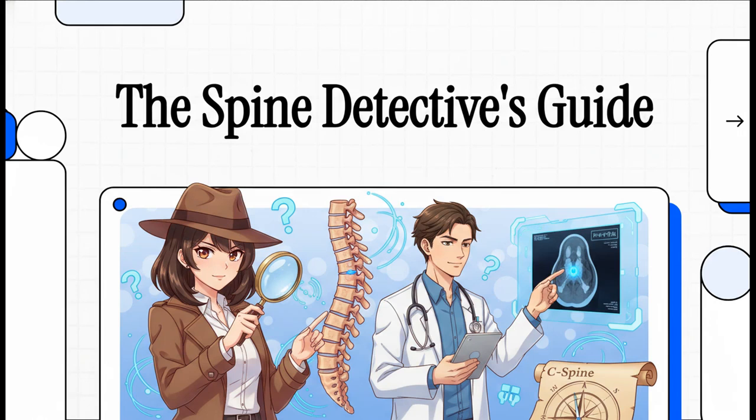All right, let's play detective. You've got a patient, they've got serious spinal symptoms. And the MRI, well, it shows a lesion. And that lesion could be anything. This is a real mystery. And to crack the case, we have to start with the single most important clue there is.